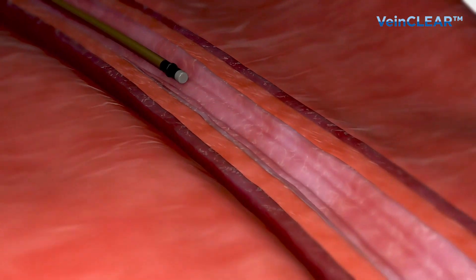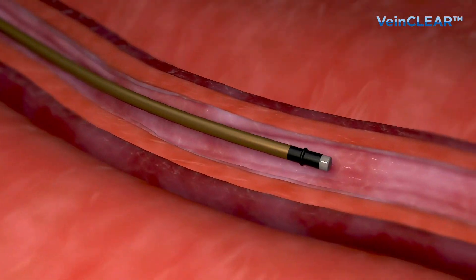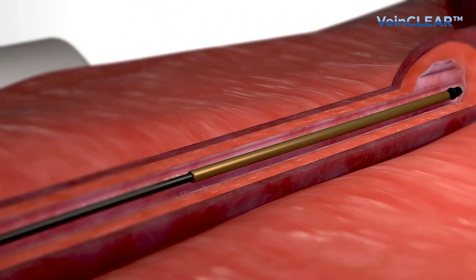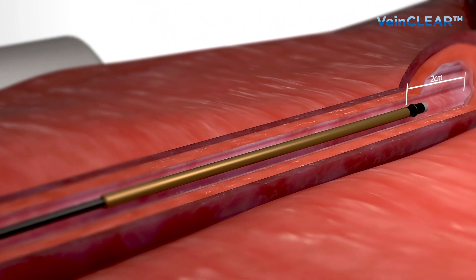The catheter is inserted up to 2 centimeters away from the sapheno-femoral junction in order to prevent side effects such as EHIT, endovenous heat-induced thrombosis.